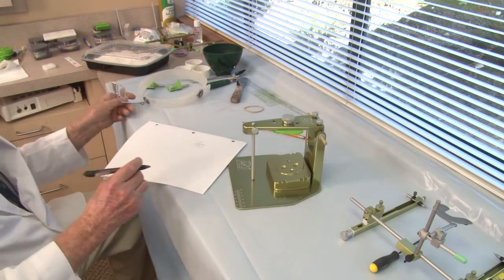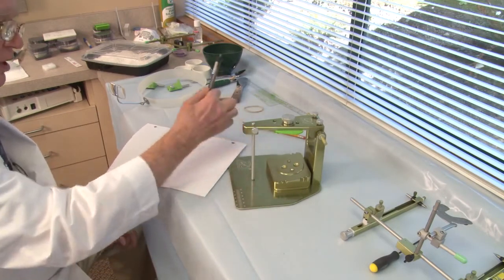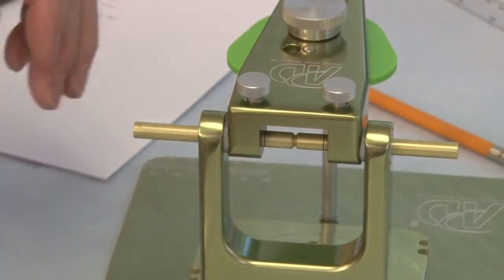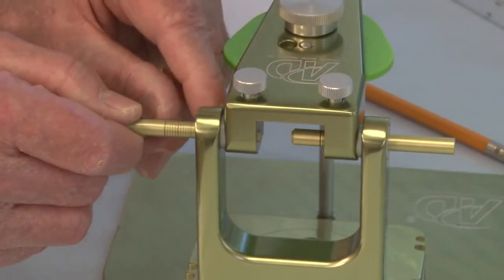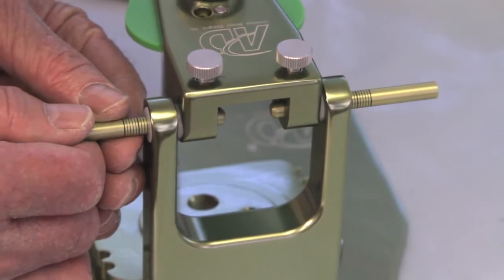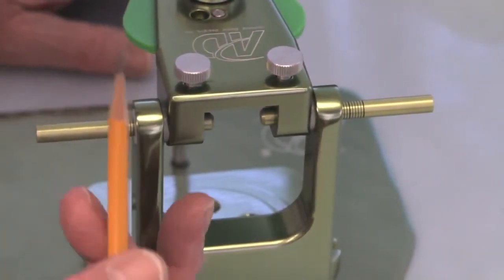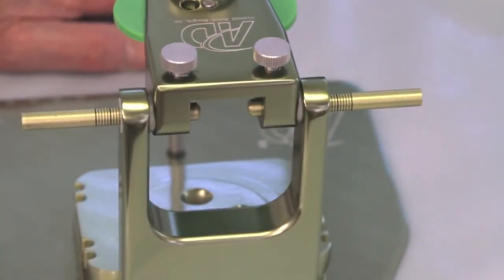Now, if I divide that by 2, because I'm going to put half of it on one side and half of it on the other side, you get 8.5 millimeters. So I will move each of these stylus pins out 8.5 millimeters. See, the big marks are 5 millimeters. So if I go in, there's 8. So I come a little bit more past the 8 and lock it. Now I look to see if this little bit of space here is about the same as the space here. They look about the same.